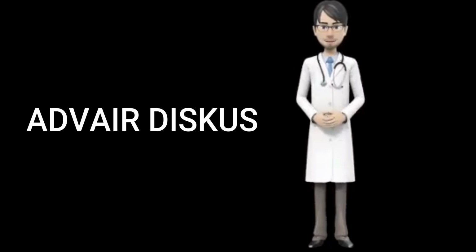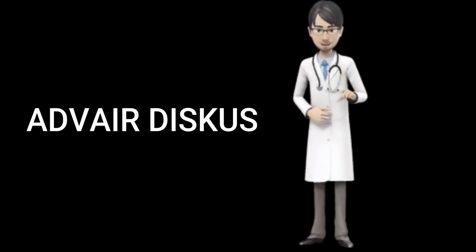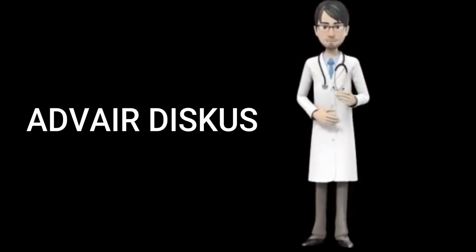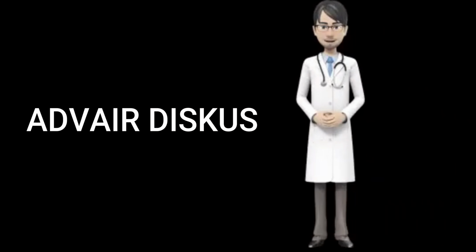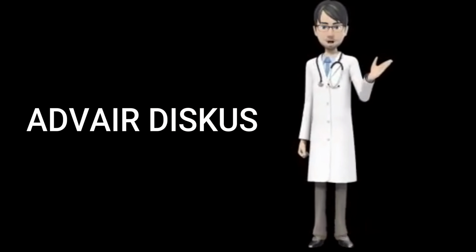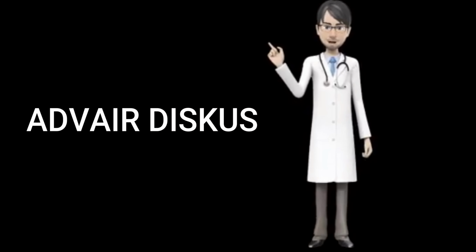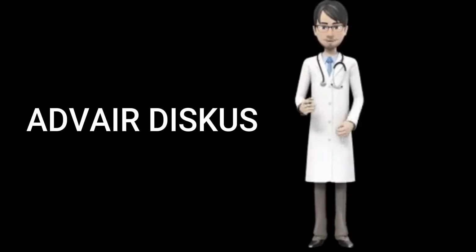If your child will be using fluticasone and salmeterol inhalation, be sure that he or she knows how to use it. Watch your child each time they use the inhaler to be sure that they are using it correctly. Never exhale into the inhaler, take the inhaler apart, or wash the mouthpiece or any part of the inhaler. Keep the inhaler dry. Do not use the inhaler with a spacer.